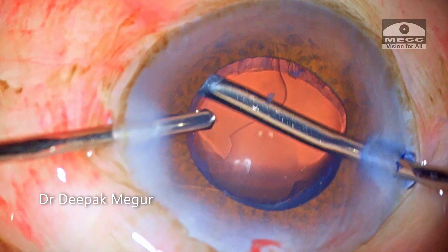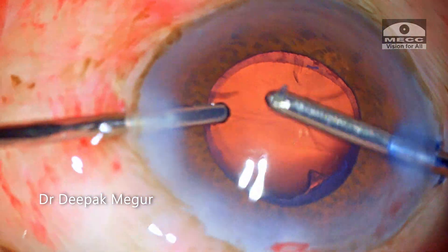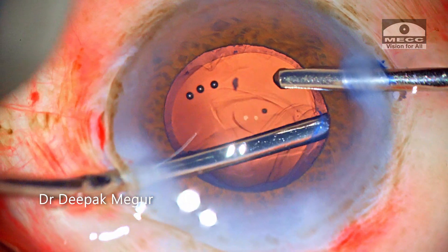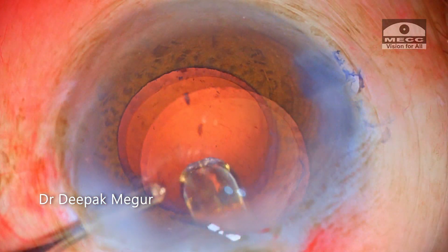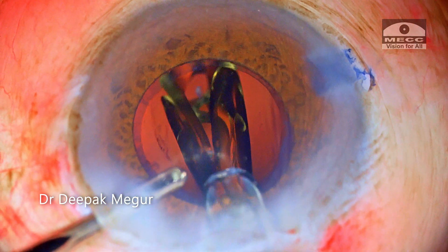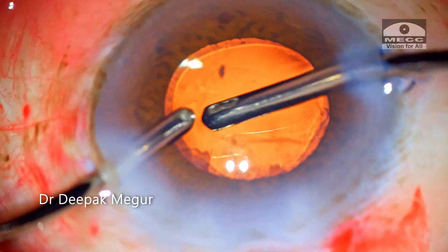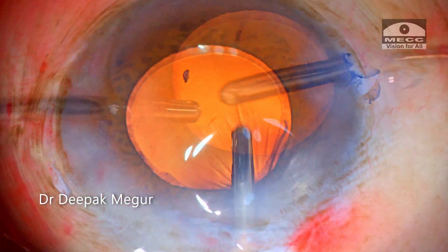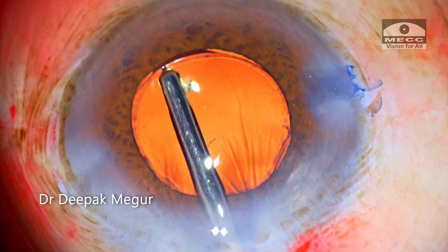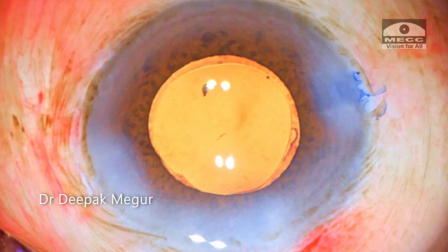The cortex is aspirated. The intraocular lens is implanted into the bag. The OVD both in front of and behind the lens is removed. The side ports are hydrated and the case is done.